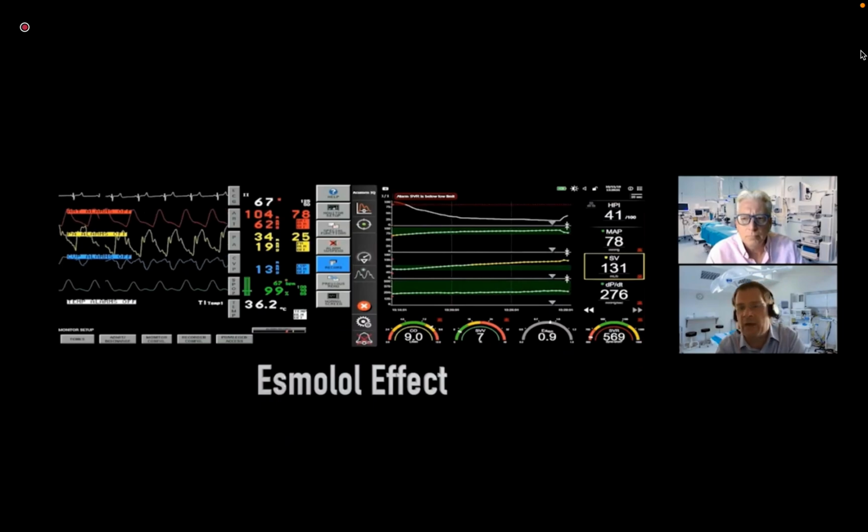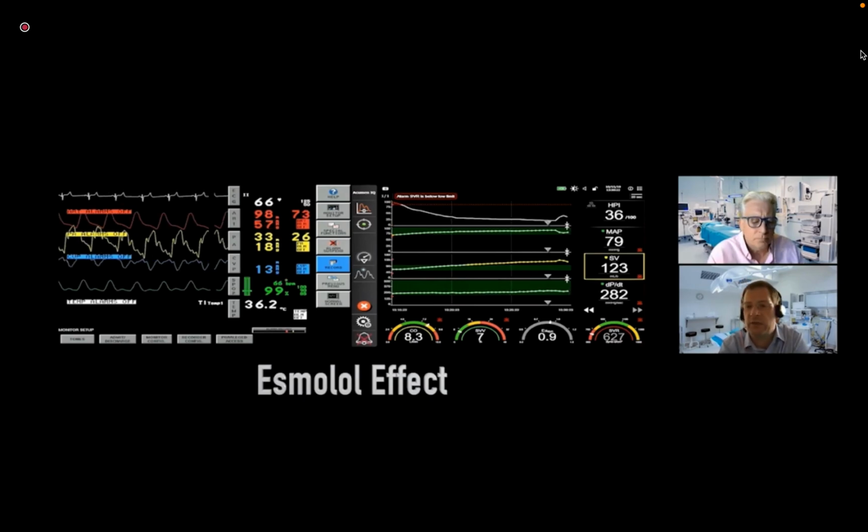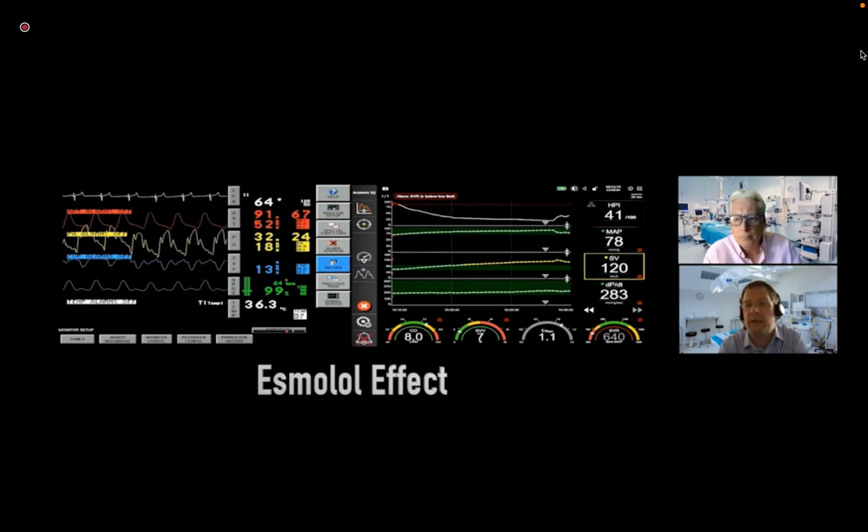So the bolus has been given, HPI starts to rise, and I think, as we talked about before, Monty, HPI cannot predict this kind of external influence or intervention, but it will react to it. And what we should see eventually is our contractility, so DP/DT, start to decrease, HPI will increase, and our stroke volume should start to drop.